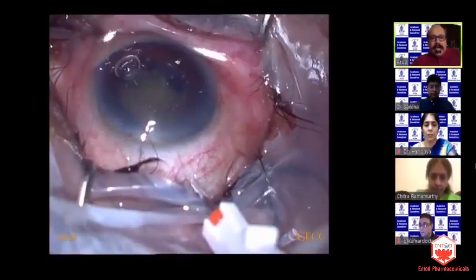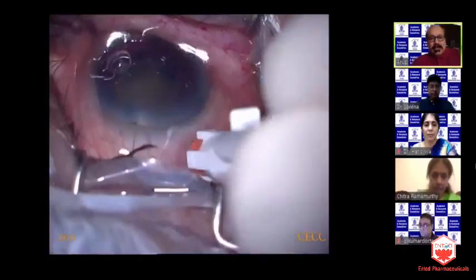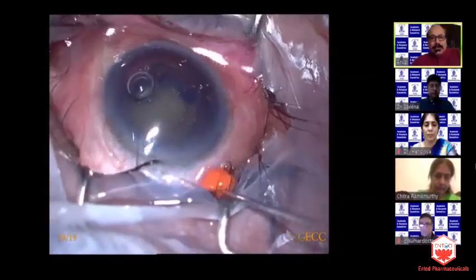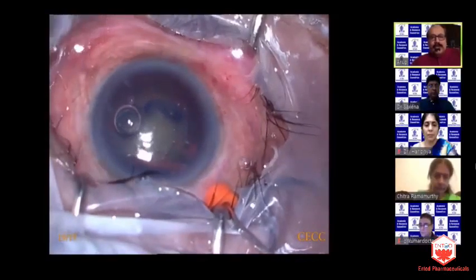Now, I have trained myself. My wife is a VR surgeon, so I have watched her videos and I have assisted her, and she has assisted me for a couple of cases. So if you have not learned how to do it properly, I would suggest that you don't do this particular procedure to soften the globe, to reduce the intraocular pressure.